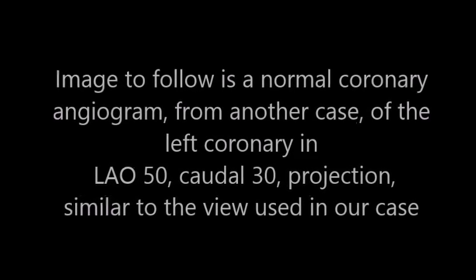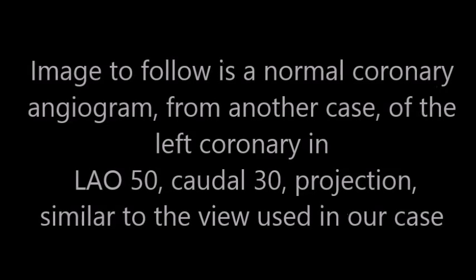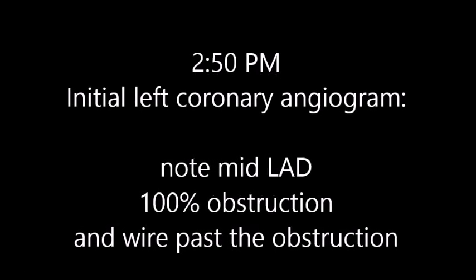Hypotension few hours post-coronary angioplasty. Image to follow is a normal coronary angiogram from another case of the left coronary artery in an LAO 50-degree caudal 30-degree projection. Note the LAD on the left upper corner.